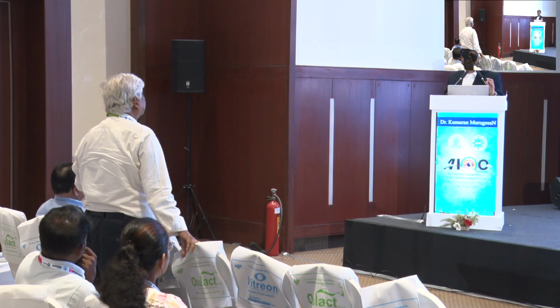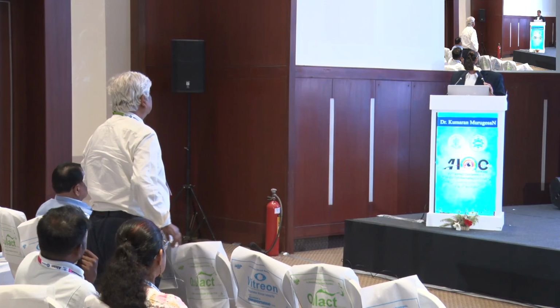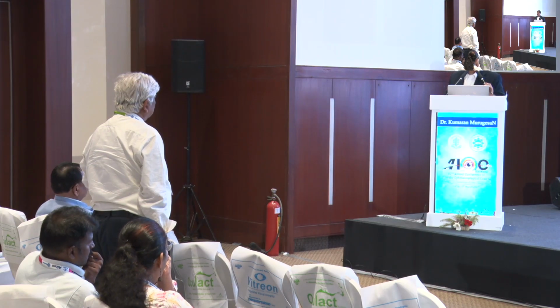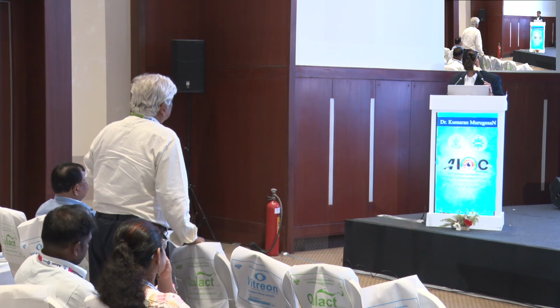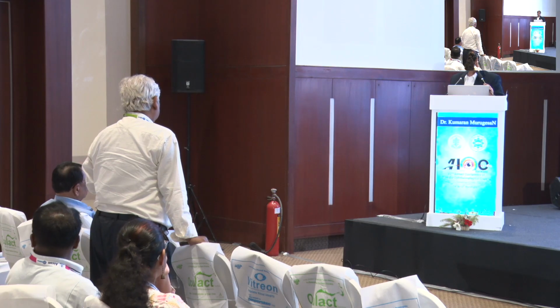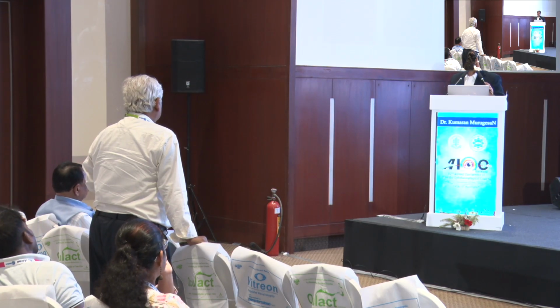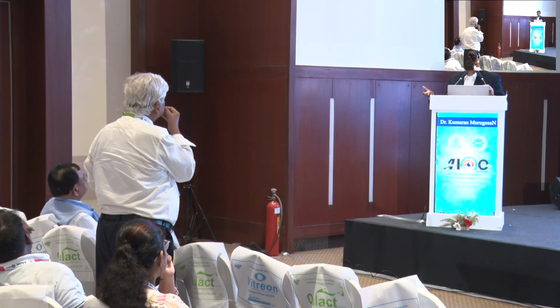So to the best of my knowledge, in my opinion, these air sterilizers would not work because there is no proper validation to ensure that these sterilizers work well. It is not just an air sterilizer. The capacity of the air sterilizer has to be calculated by your AHU specialist, who calculates the amount of air coming into your theatre and the amount of air going outside. Only then will an air sterilizer work. So these makeshift air sterilizers do not work that way.